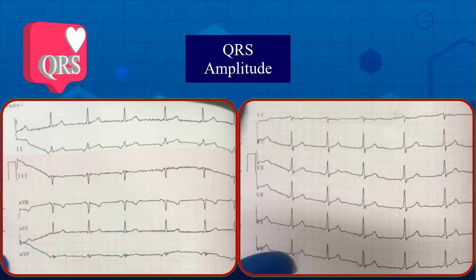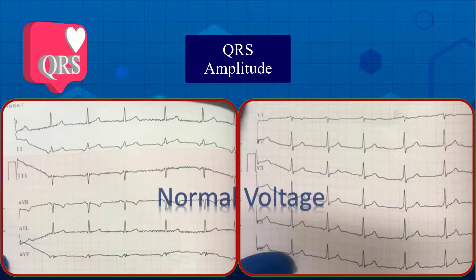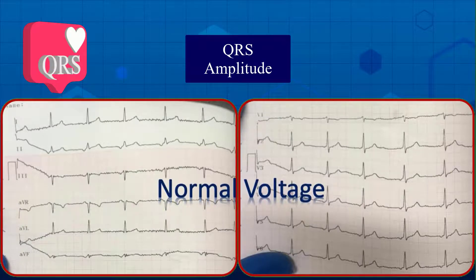Second: QRS amplitude. The QRS complexes are more than 5 millimeters in limb leads and more than 10 millimeters in precordial leads, so they are not low voltage. On the other hand, there is no finding in favor of ventricular hypertrophy. In general, the QRS complexes have normal voltage.